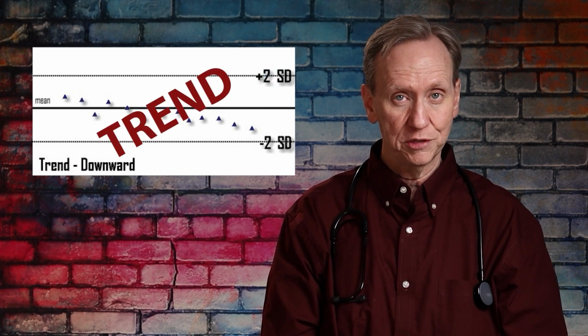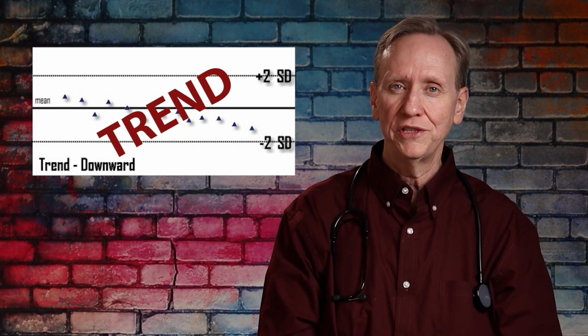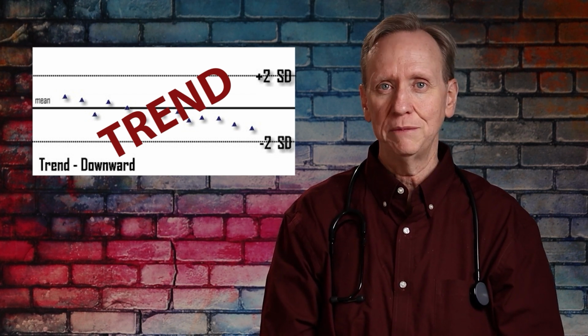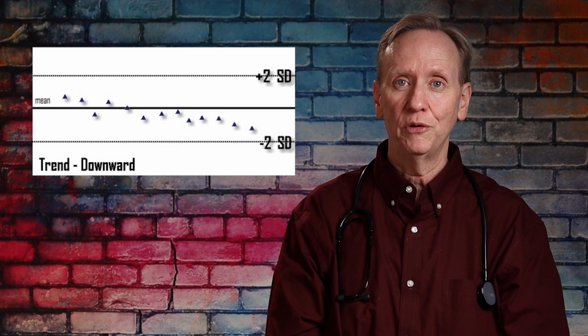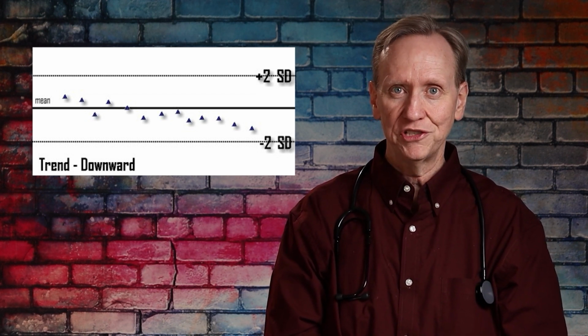Now, you can still use this machine, but we want to watch it more closely. Think about this. These points are happening about every shift, and this means if this trend keeps going, in the next 2 or 3 shifts, we might start getting points that are above or below a control limit. And then the machine would be out of control.